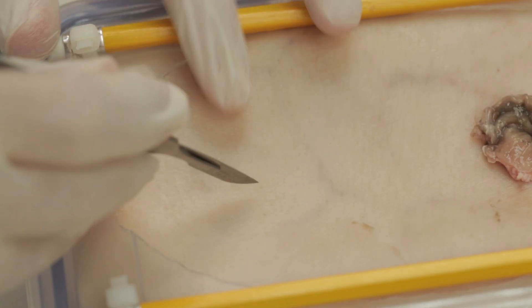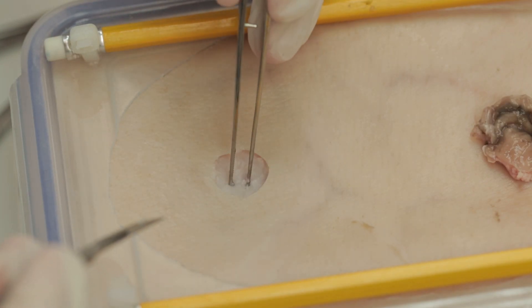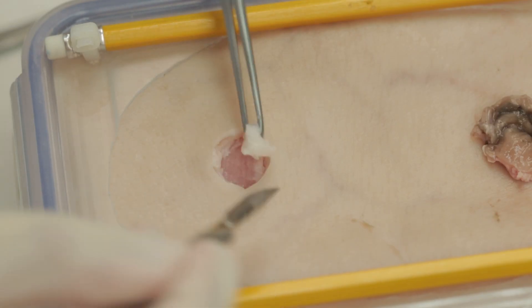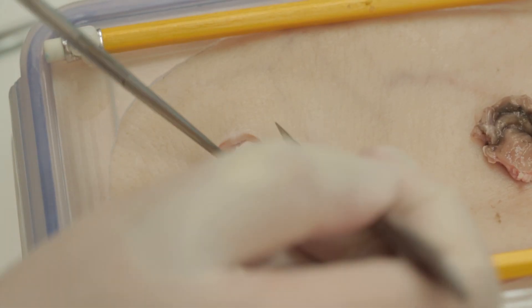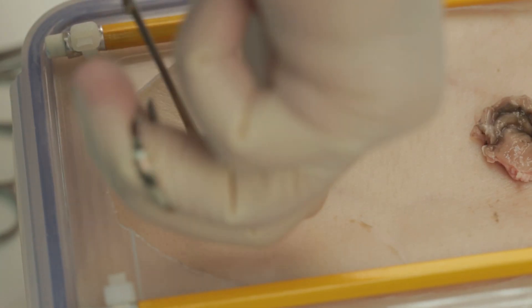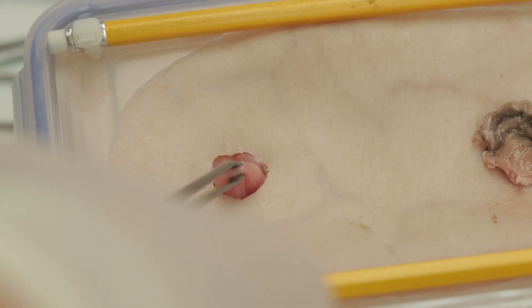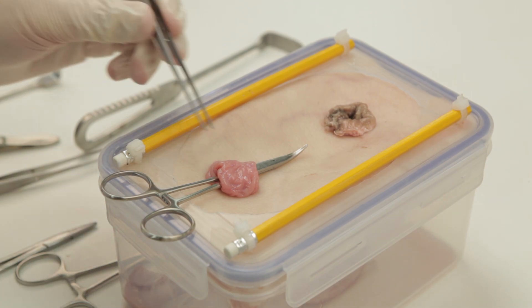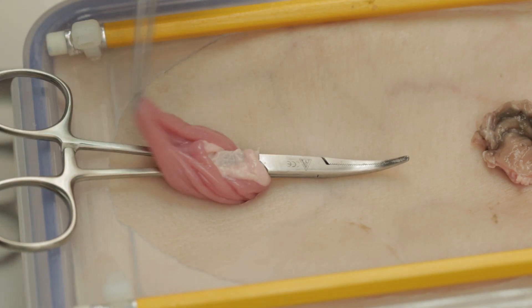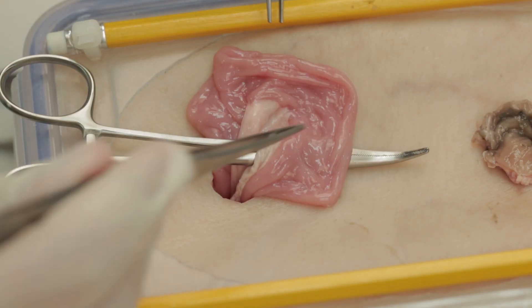To form an ileostomy, a similar approach is taken for the dissection. A circular incision is made and a disc of subcutaneous fat is dissected out. The muscular layer is dealt with in a similar manner, and an atraumatic bowel clamp should be used to deliver the ileum onto the abdominal wall. Again, for the purposes of simulation, we have used an Alice clamp, which should never be used on a patient. Once you have delivered the small bowel, inspect it to make sure it's not twisted around its mesentery and that the efferent and afferent limbs are clear.